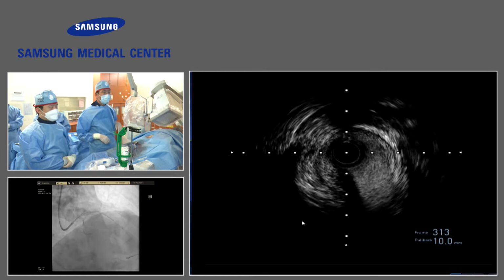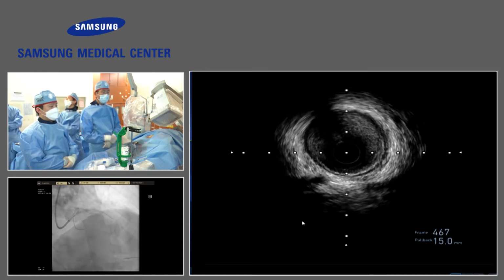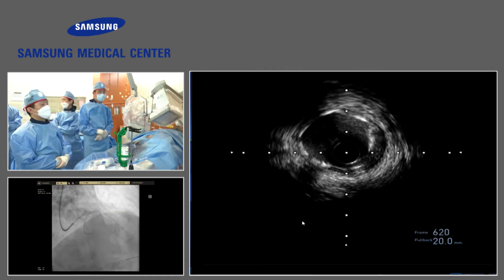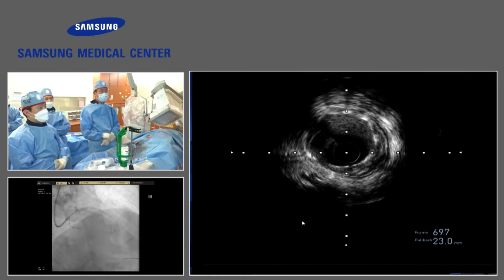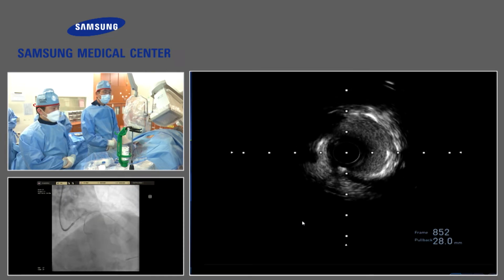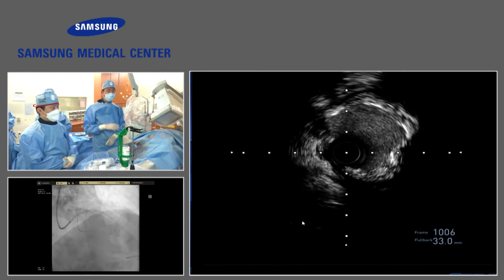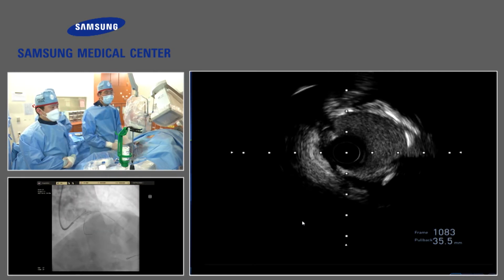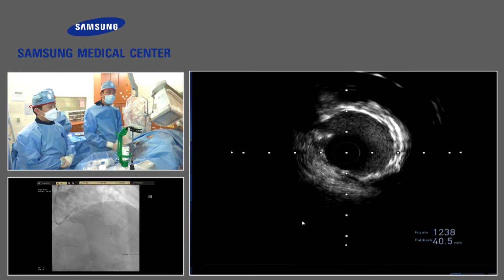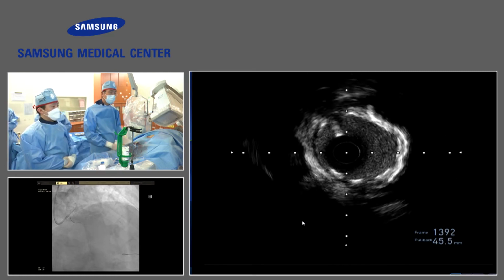This is the white bleaching, just distal to the LAD. Then comes a stent here. Not well apposed, right? That is the importance of intravascular imaging. But the length of the malposition is not so long. By IVUS size, actually, we should have used 3.0 rather than 2.75. Anyway, only the diagonal side is passed. This is proximal LAD.